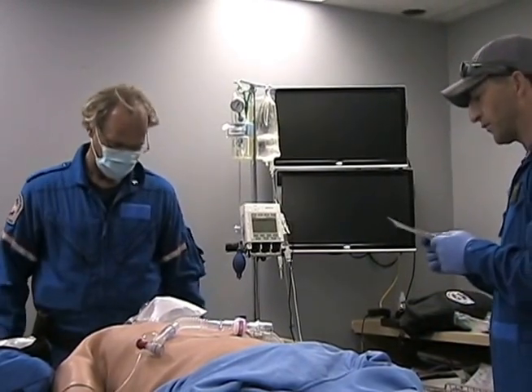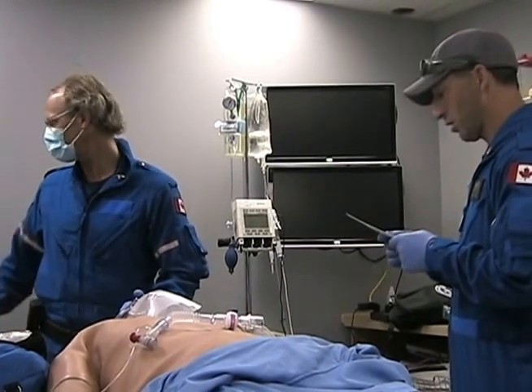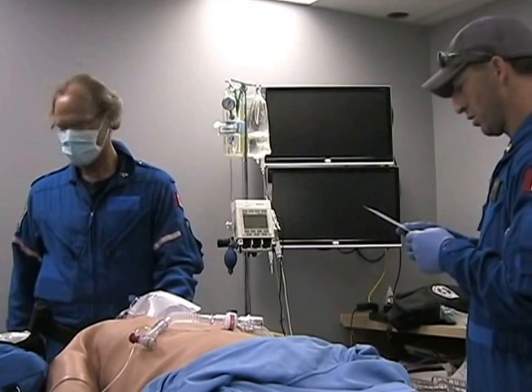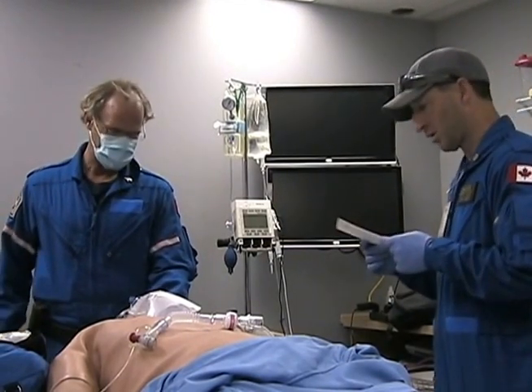Okay, nasal prongs 15 liters and NRB, BVM, PEEP valve. They're on, and we've got the BVM and PEEP valve here for later. Okay, O2, two sources on, sufficient amount. Both sources are on and a good amount. Monitor on. Monitor is on. Vital signs assessed. Vital signs have been assessed.